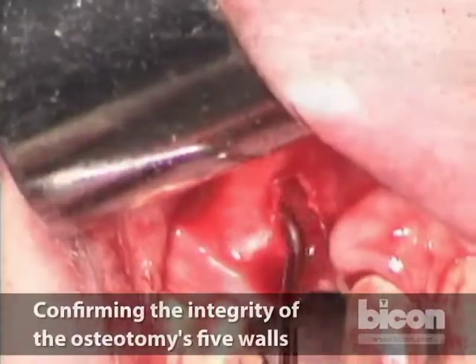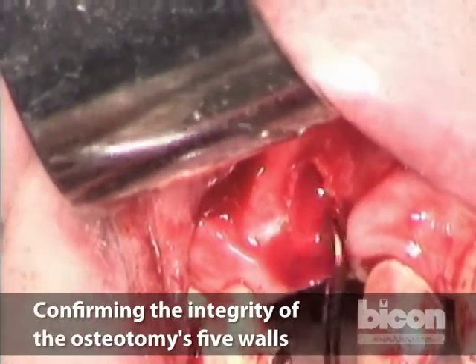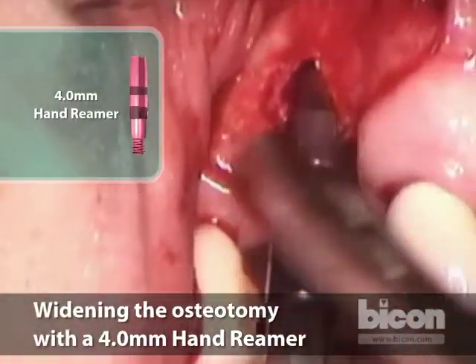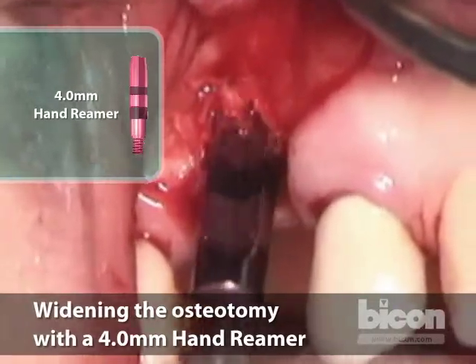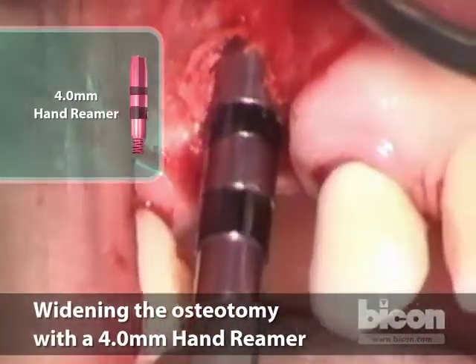Okay, and the key is to introduce the reamers. Fully suction on the buccal, don't worry. Okay, good.